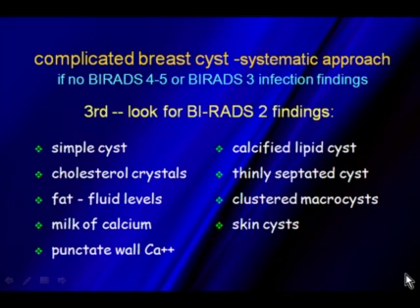Now, looking at this, we're going through our systematic approach. We have tried to clear up any artifacts.